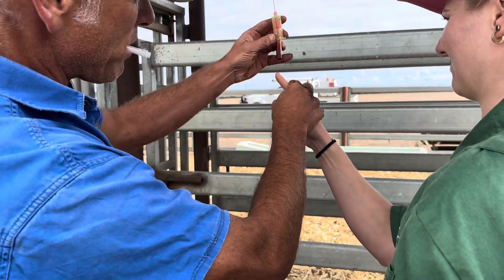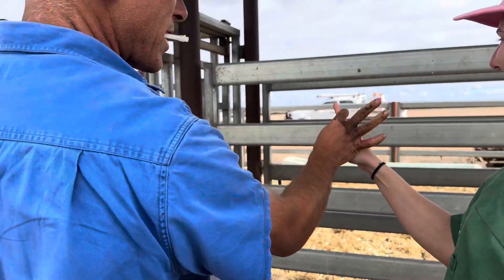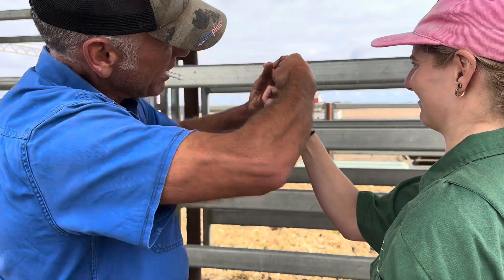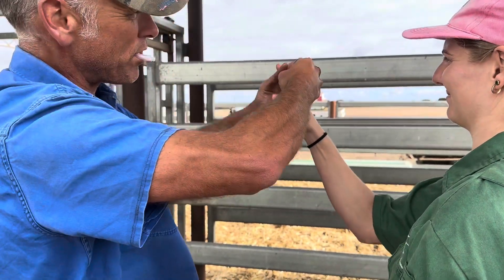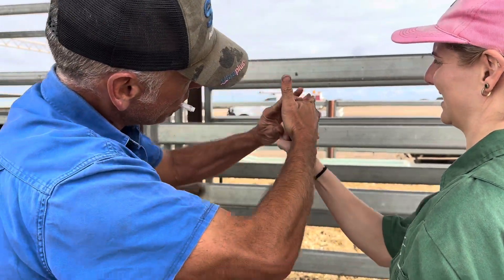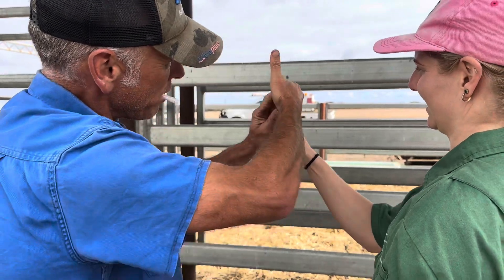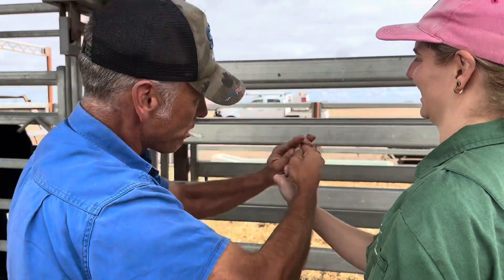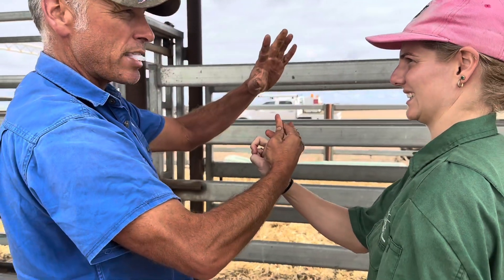My hands are a bit dirty but I'll show you the trick. You get the needle there with your finger — instead of hanging like this and trying to poke it into the tail, because if the animal moves it's going to pop in and blow the vacuum. I put my finger up against the side of the needle. As I pop it in going into the tail, this hand is up against the tail — holding the tube. So if the animal jumps around, you're not popping out and blowing the vacuum. Does that make sense?